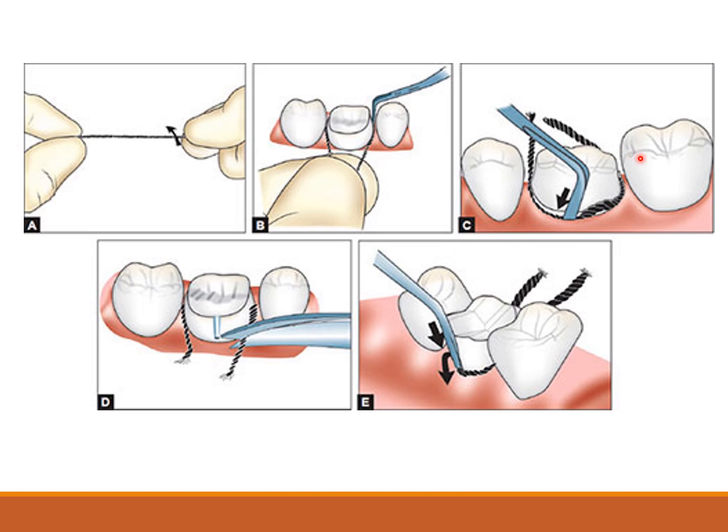This is again just showing how you do it. So you take the cord, you measure it around the teeth, you twist the cord, you cut the excess, and start packing from the mesial. You take the cord packer from the mesial to the distal, subgingivally, with a pushing motion. This is already placed in, this is out. So going from mesial to distal, the excess is cut and it is pushed, the impression is made, and then the cord is taken out later.